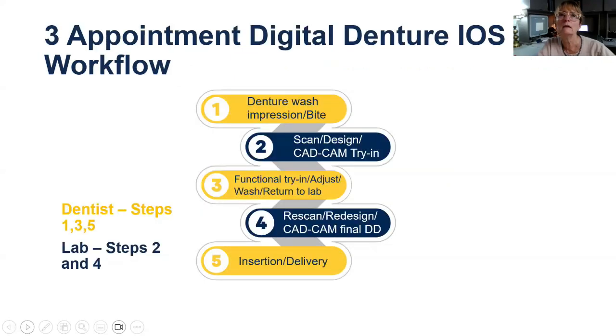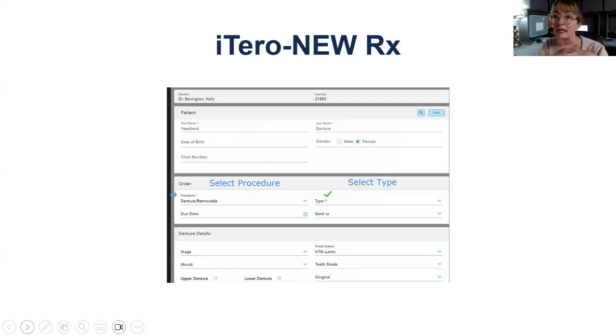Question. How are you repairing fully printed dentures? That's a really lovely question, because what we're experiencing is that there really isn't a need to repair them. We're not experiencing a denture tooth popping off. You won't experience that because it is printed. So the gingival tissue is printed separately than the teeth, and then they're chemically bonded together.